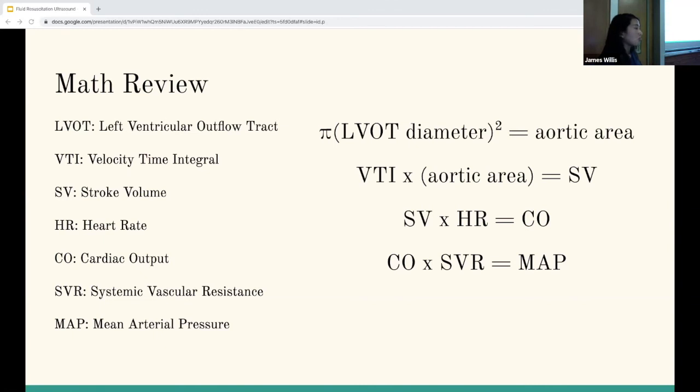Yeah, and I think that's kind of the point. A lot of people have trouble finding the IVC. Sometimes there's gestalt in the assessment, and I think the point of this is here's another extra point that you could use in the picture to guide you. Yeah, for sure.